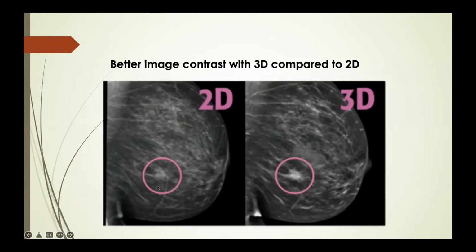There are other imaging modalities used for breast, for example, ultrasound, but the contrast is not very good, even for very young women who are, like I said, below the age of 40. And if the doctor suspects that this person has cancer, mammography is not usually the first modality you'll be asked to do. They will probably do ultrasound, which uses sound for imaging, so it's not harmful, not like radiation.